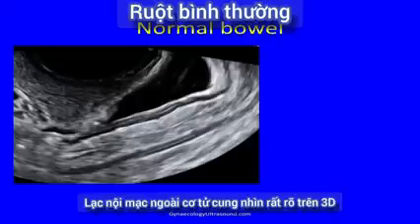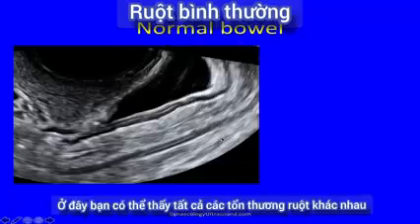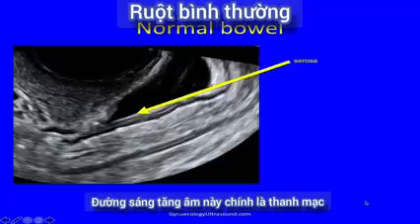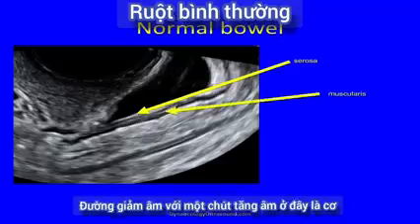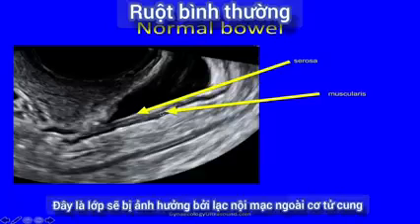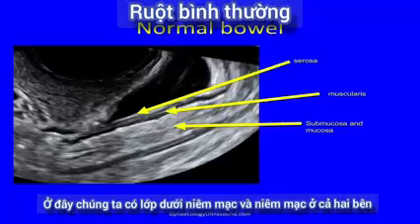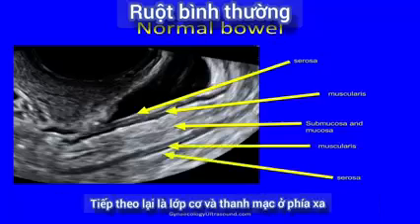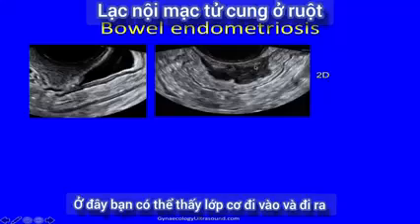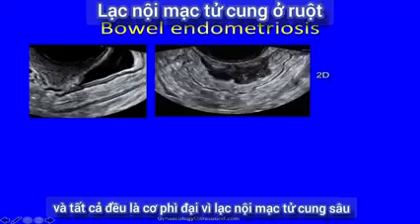Endometriosis is very nice to see on 3D. This is a 2D image of normal bowel — we're looking through the posterior fornix, and you can see all the different bowel layers clearly because there's a little bit of fluid in the pelvis. This hyperechoic line is the serosa, the hypoechoic line with a little hyperechoic is the muscularis, and this is the layer affected by endometriosis. Here we've got submucosa and mucosa on both sides, then muscularis again and serosa on the distal side. Bowel endometriosis affects the muscularis layer — here you can see normal muscularis going in and out, and all of this is hypertrophied muscularis caused by deep endometriosis.